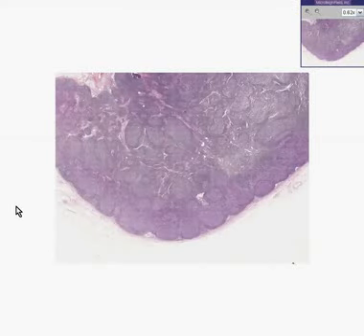In my primitive way of thinking, I guess you could say there's three kinds of lymph nodes. There's totally normal lymph nodes, which follow the classic histology textbooks. And then there's enlarged lymph nodes, and the enlargement may be because of benign hyperplastic or reactive changes, or they may be enlarged because they have primary or metastatic tumor.